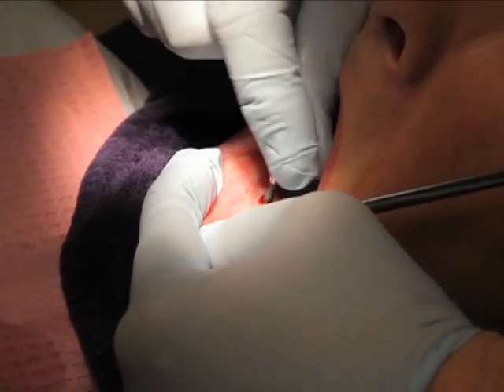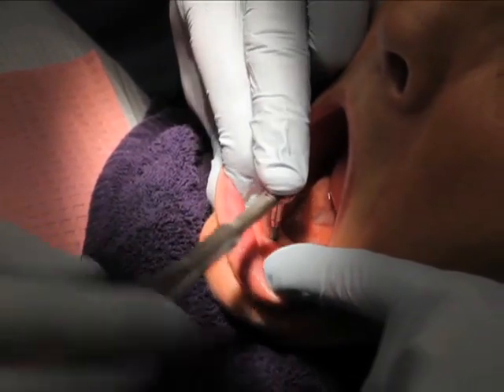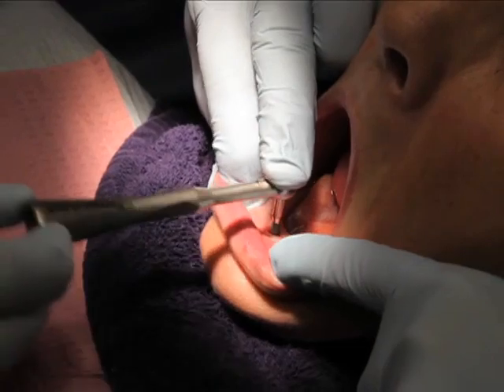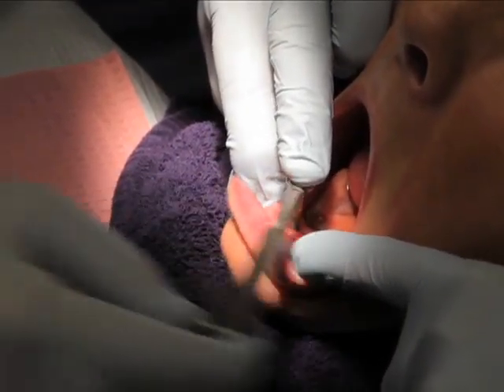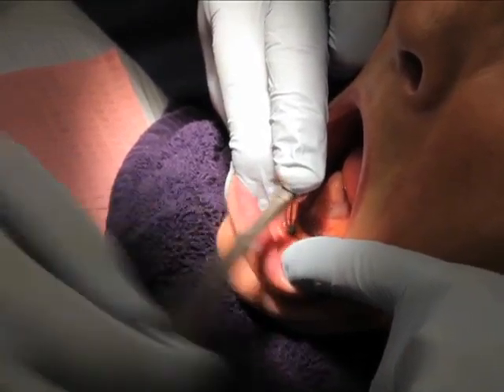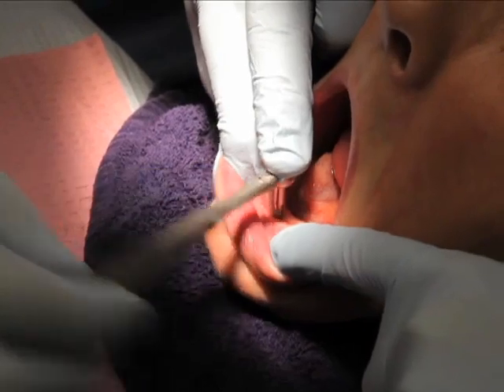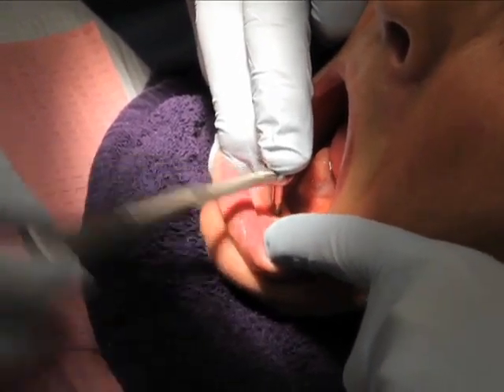In this case, the initial implant was inserted to a torque of over 50 Newton centimeters, which indicates outstanding primary stability of the implant. It's absolutely critical, however, that the implant be stable after placement. There must be no mobility.